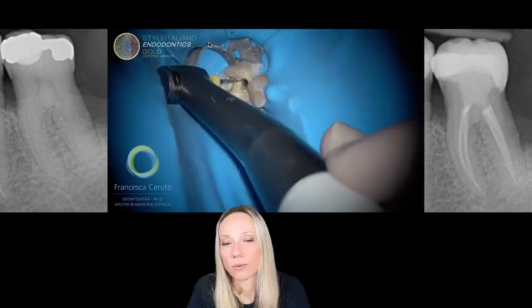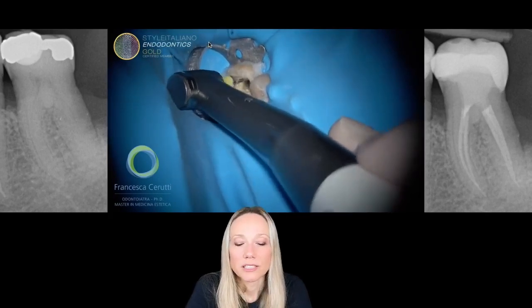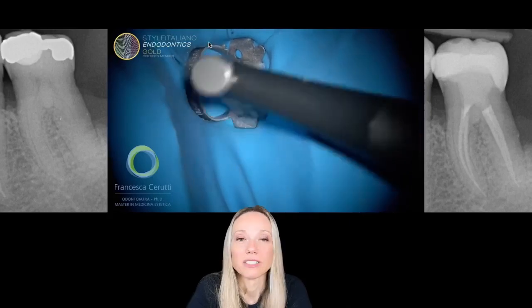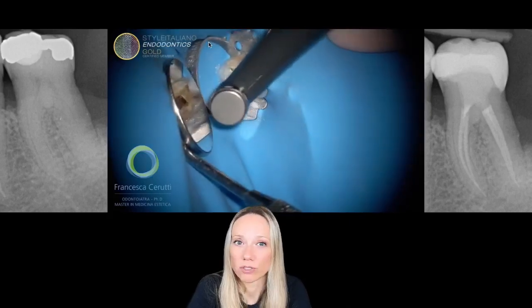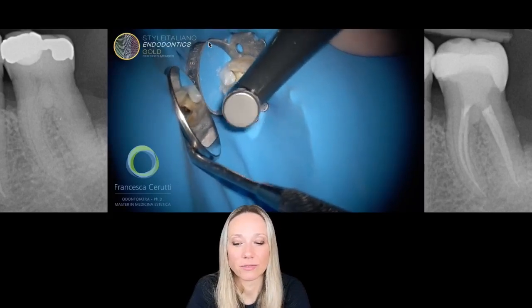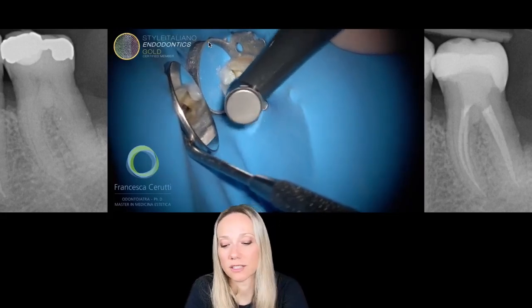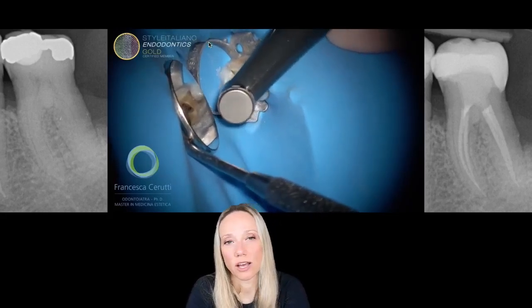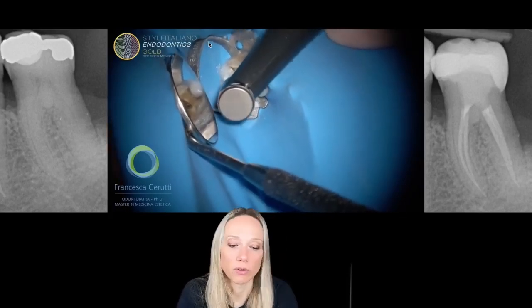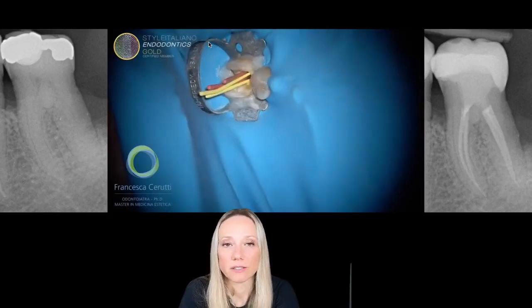Buccal, mesiolingual, distal. And what's another thing that I try to spot as soon as possible? The presence of confluences, for the reason that I was telling you before. So if I understand that there is a confluence both in the mesials and in the distals, then I know which canal I have to shape up to the working length and which canal I have to shape up to the confluence. So I want to make my life easier.